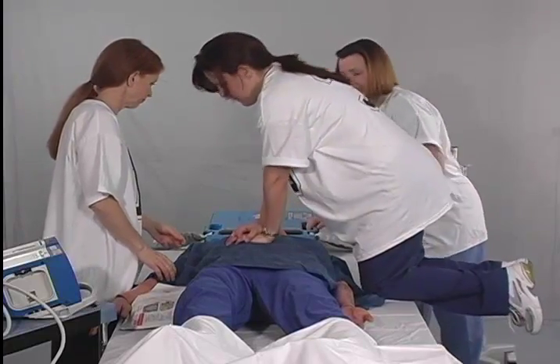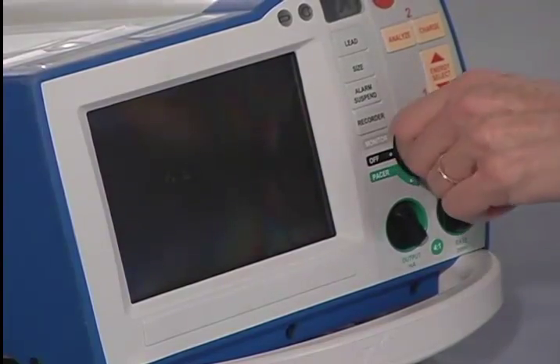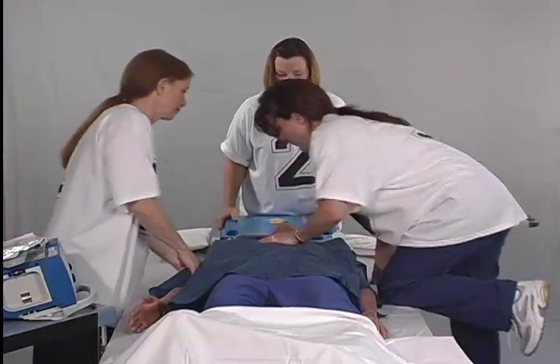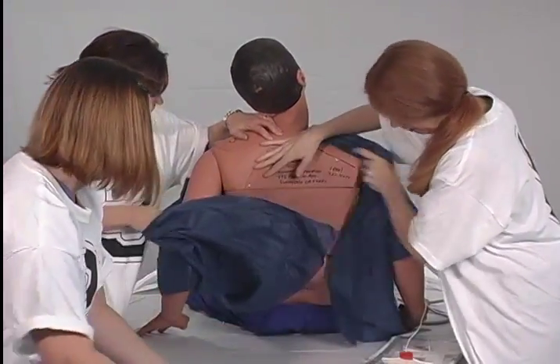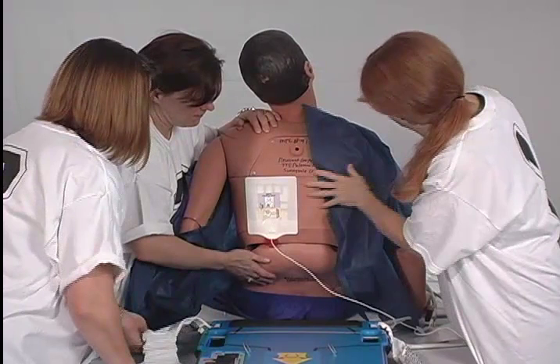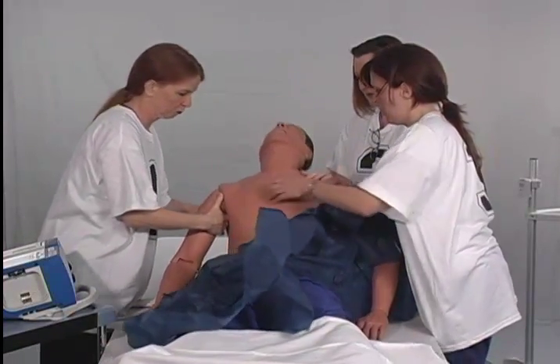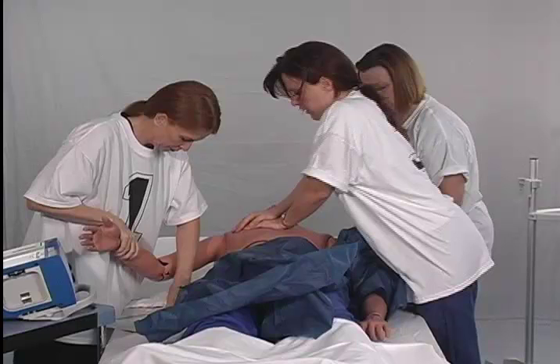Staff member number one prepares the defibrillator for use. He or she places the defibrillator to the right of the patient and to the right of him or herself, then turns the defibrillator on. He or she sits the patient up or log rolls to the side in conjunction with number three and removes the patient gown from the back and applies the posterior defibrillator pad if using anterior-posterior placement. While the patient is still in the sitting position, number two slides the autopulse into position underneath the patient. Number one and number three then lay the patient back onto the platform, remove the gown from the front, and position the patient so that he or she is centered laterally and the armpits are aligned on the yellow guideline.